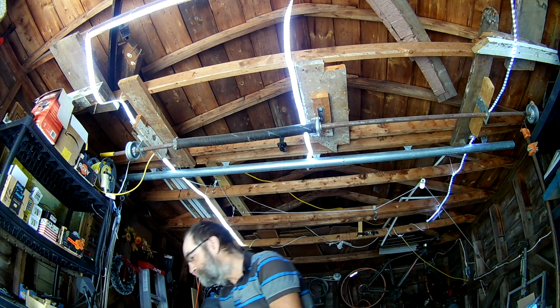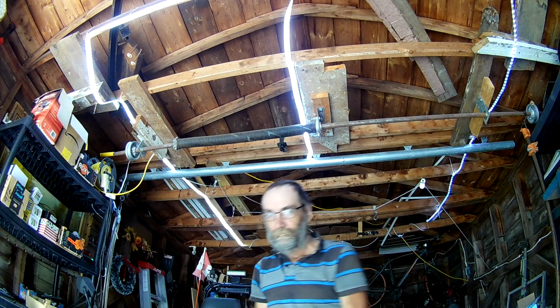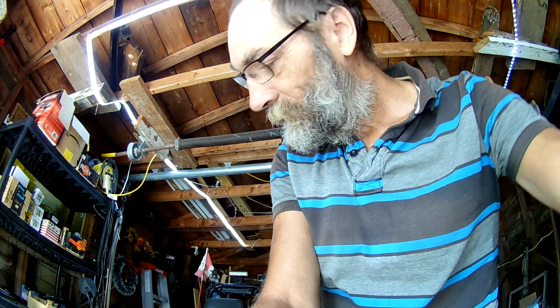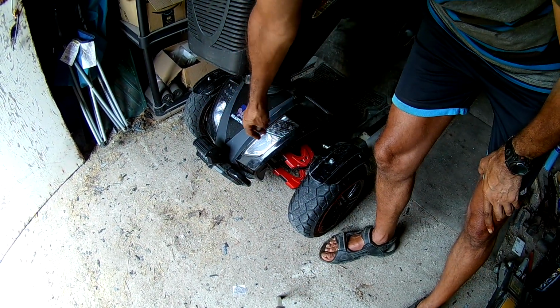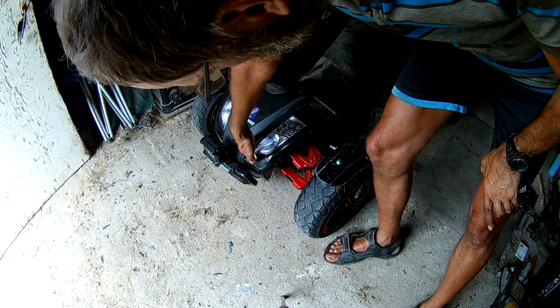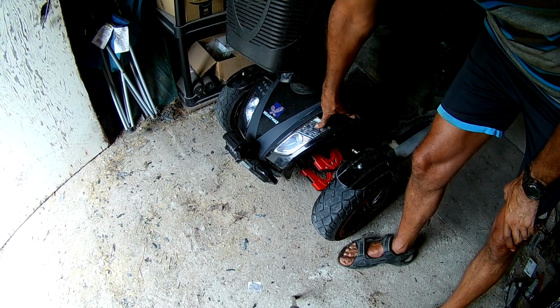Because I'm not sure how long it's been since I talked about that, I'll explain it now. So when I turn my headlights on, the only thing that's coming on are the actual headlights themselves. These orange lights are not coming on.